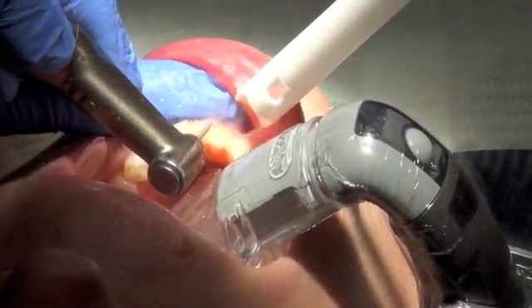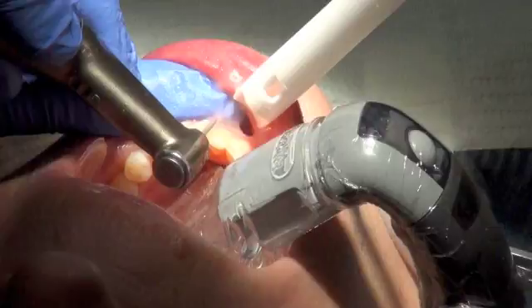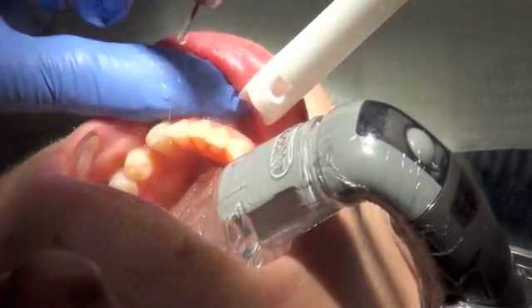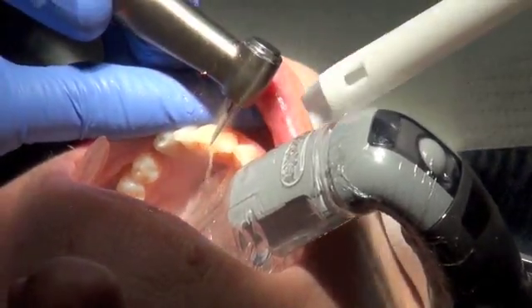The rough draft was then re-contoured, as the shape of the new veneer is essential to the final outcome — not only in regards to the bite, but also the aesthetics and the looks of the final restoration.